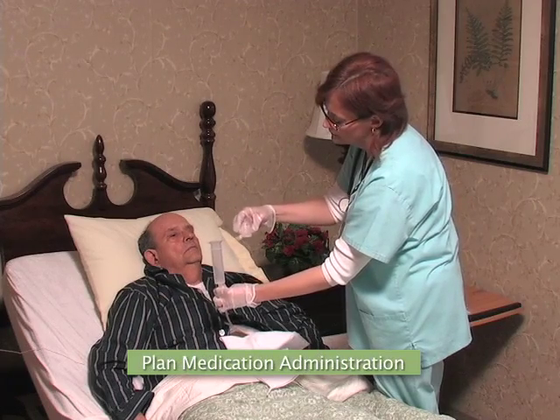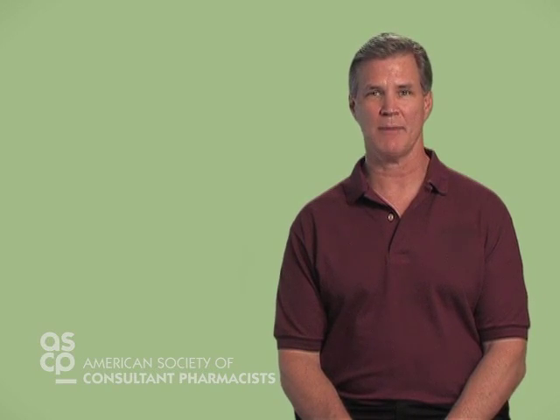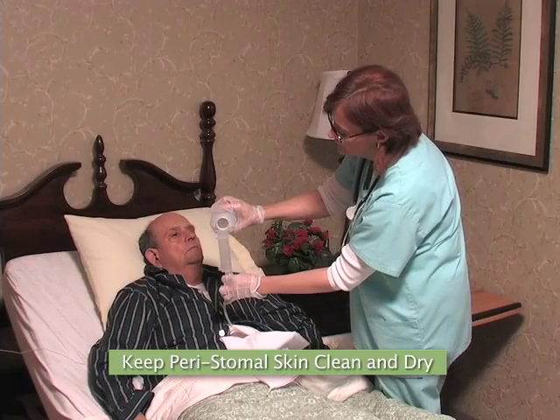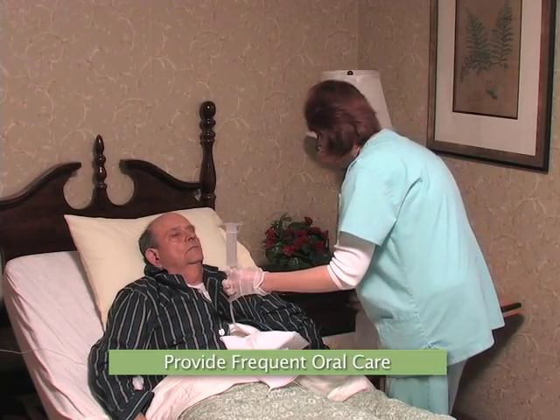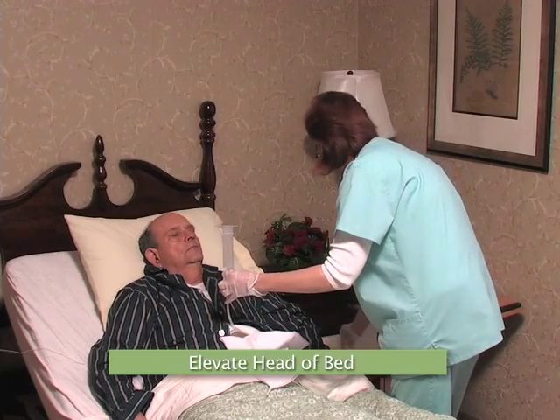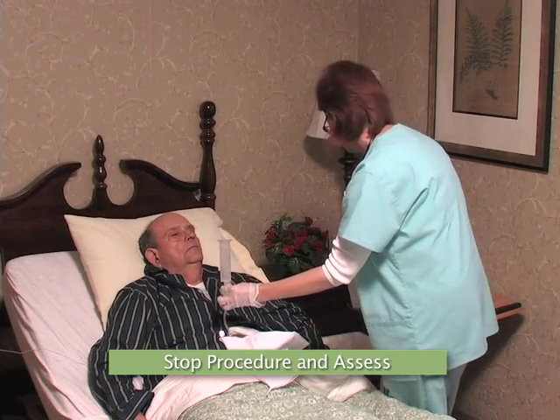If a resident has a bolus feeding, plan medication administration so that it is not at the same time as the feeding. Fluids of more than 400 cc's at one time can result in overload for any adult. Keep the skin around the G-tube clean and dry and cleanse daily as ordered by the physician. If the resident is NPO, meaning they're not taking anything by mouth, provide frequent oral care. The head of the bed should remain elevated at least 30 degrees for at least 1/2 hour after medication administration or feeding by way of the G-tube. And if the resident exhibits any sign of discomfort during medication administration, stop the procedure and assess further.